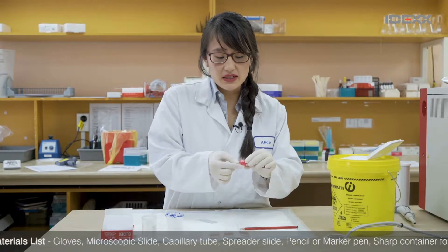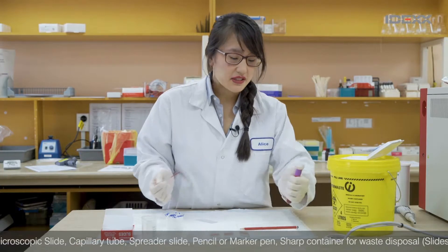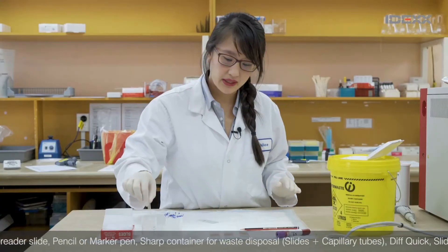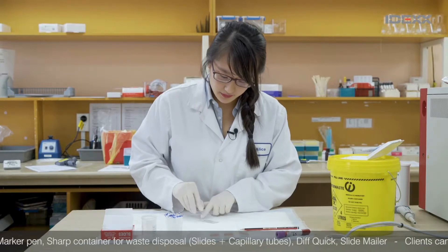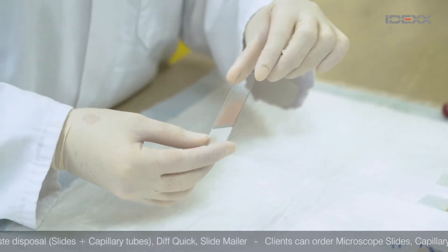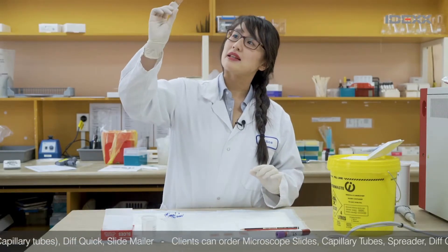Now there are a couple of ways to do it. Everyone does it slightly differently, so it's okay if you find that some people do it a little differently. Put a bit of blood on the bottom of your slide, take your spreader, draw it back into the blood and just push forward. You know that you've made a good slide when you look at the end and it's got a nice feathered edge — just hold it up to the light to make it a little more obvious.